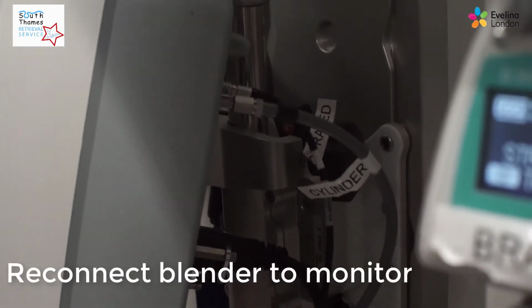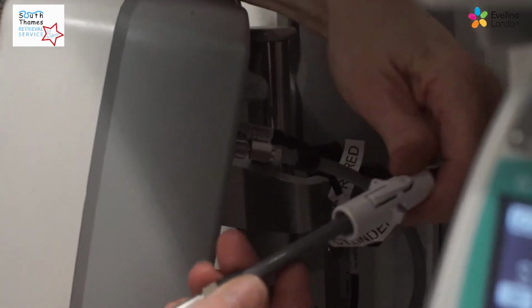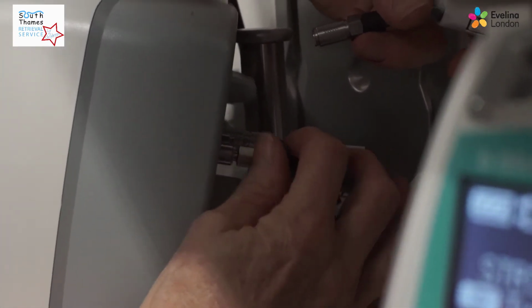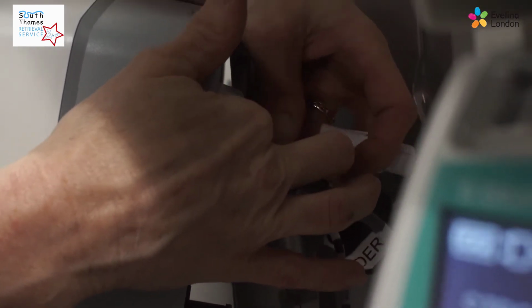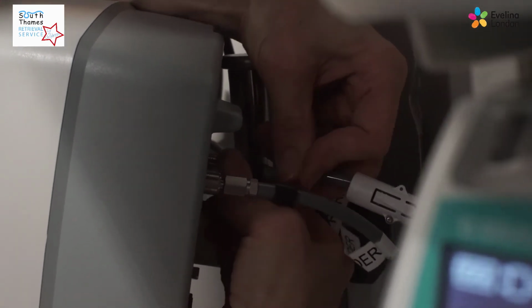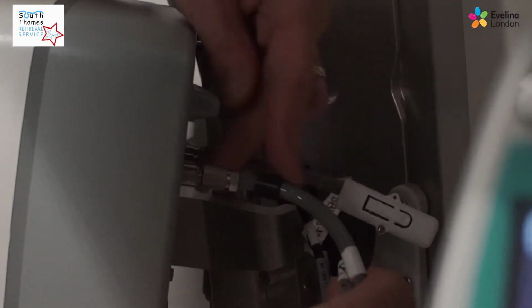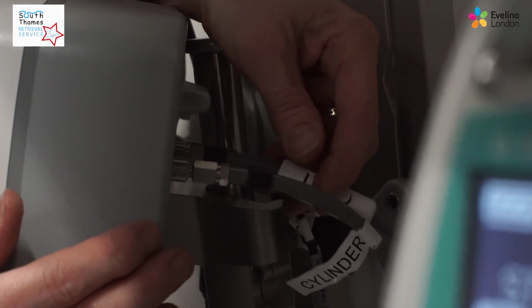So now you need to reconnect the nitric blender to the monitor. So you've got your cable, it's the one with the white bracket on it, and you need to count in three. So one, two is a gap, and three is where you put the lead into. It just clicks in place. So that's one for the nitric cylinder, two is empty, and three is where the blender gets attached.